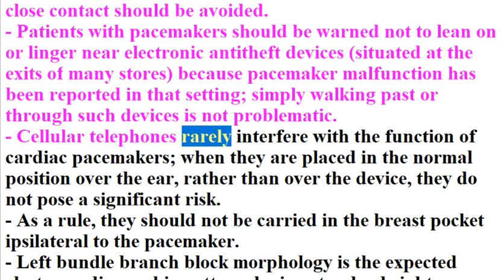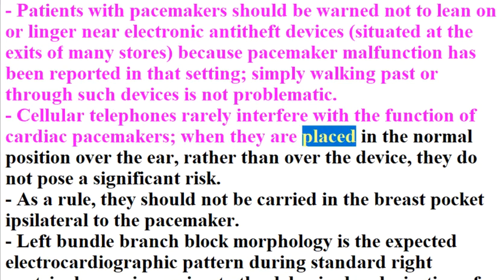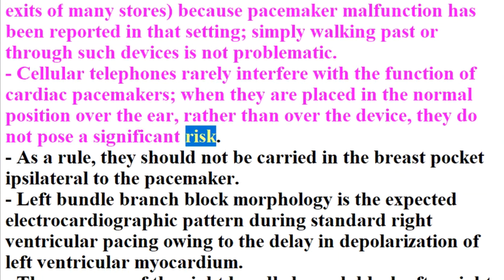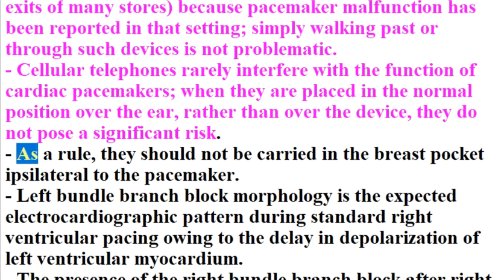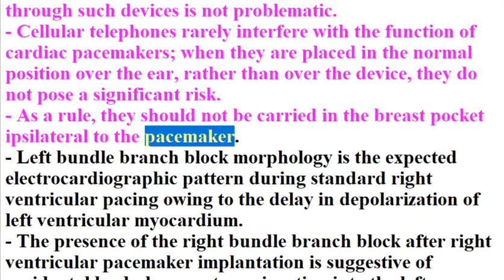Cellular telephones rarely interfere with the function of cardiac pacemakers when they are placed in the normal position over the ear, rather than over the device. They do not pose a significant risk. As a rule, they should not be carried in the breast pocket ipsilateral to the pacemaker.